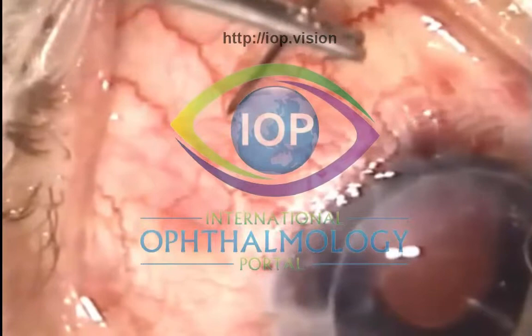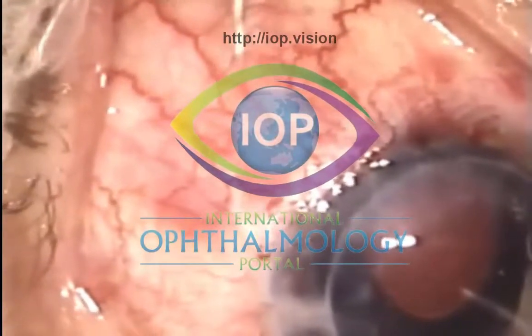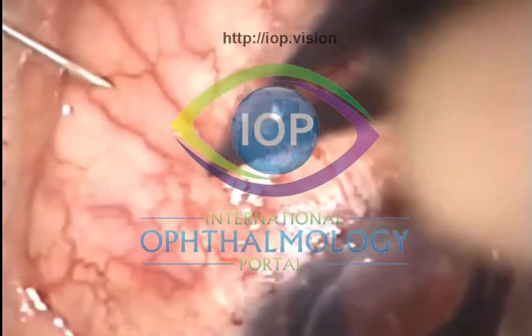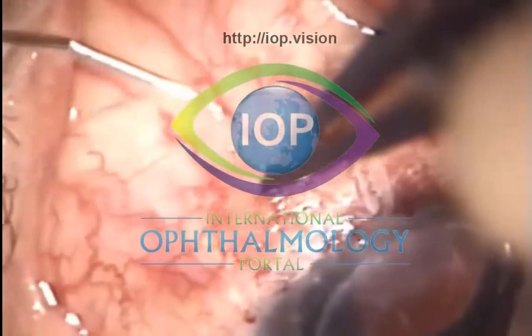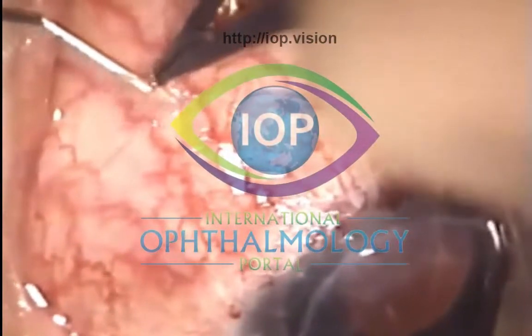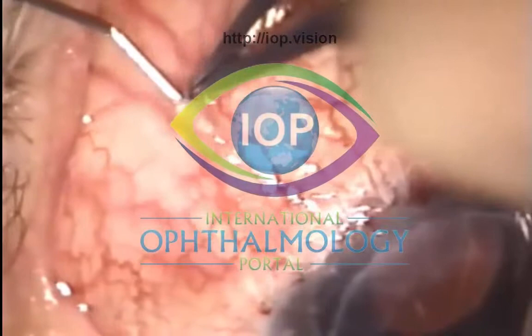...this is an only eye, and as you can see, it's had a corneal full thickness penetrating keratoplasty. Previous successful glaucoma filtration surgery, which lasted around about four years, and then I was asked to see whether I could get this bleb working again.